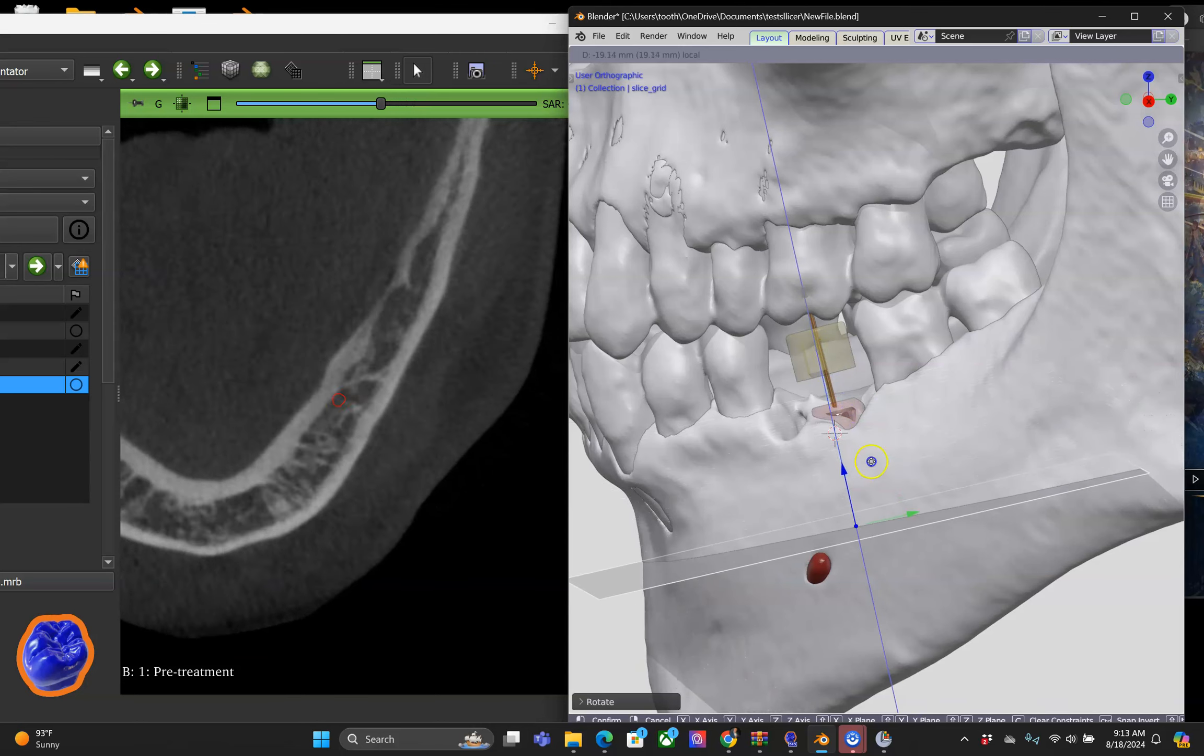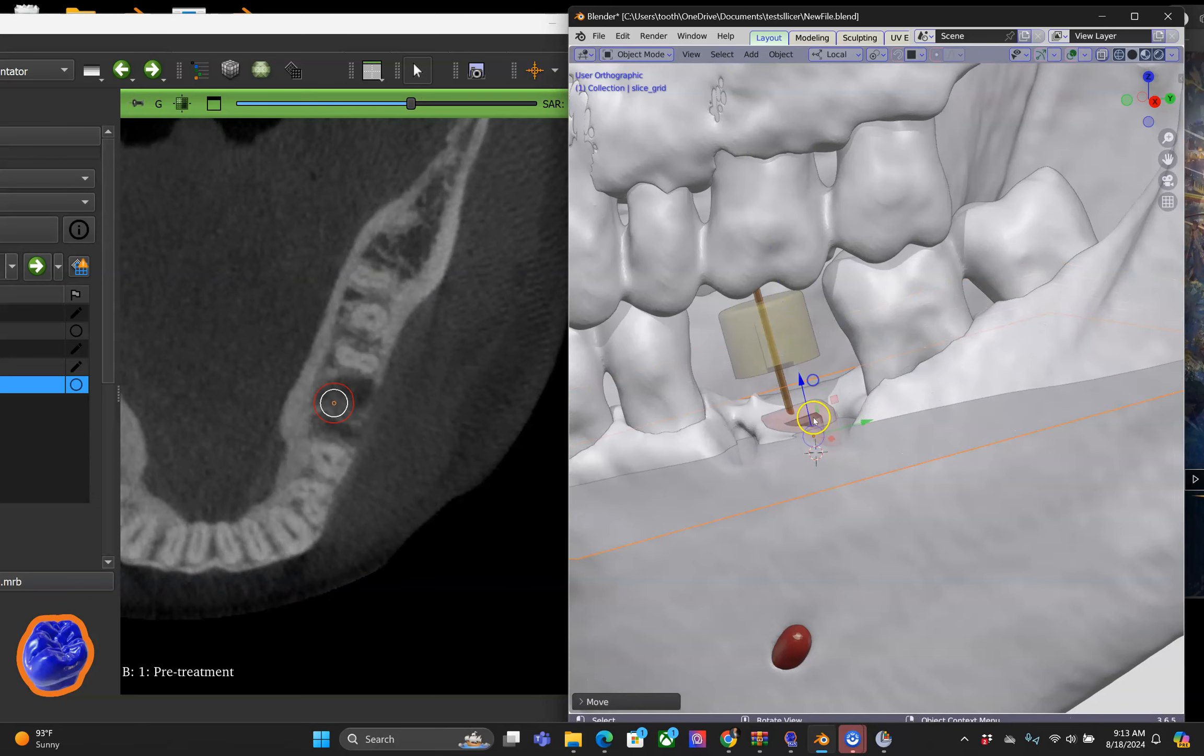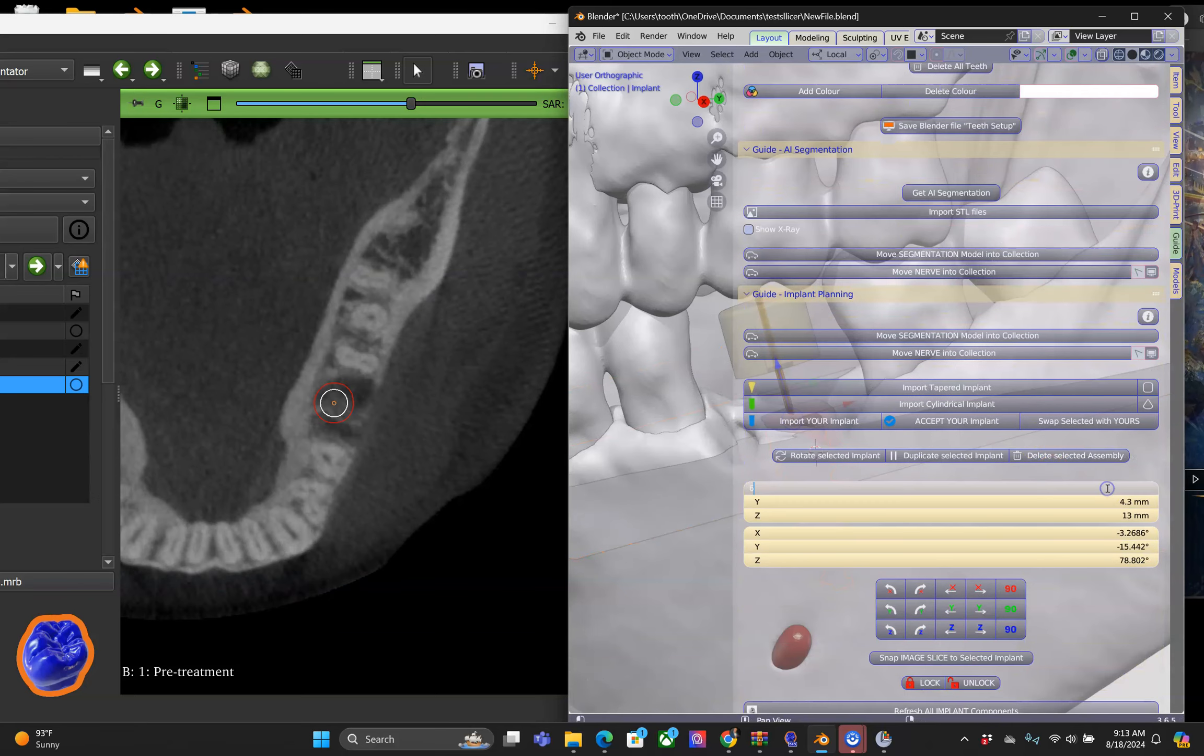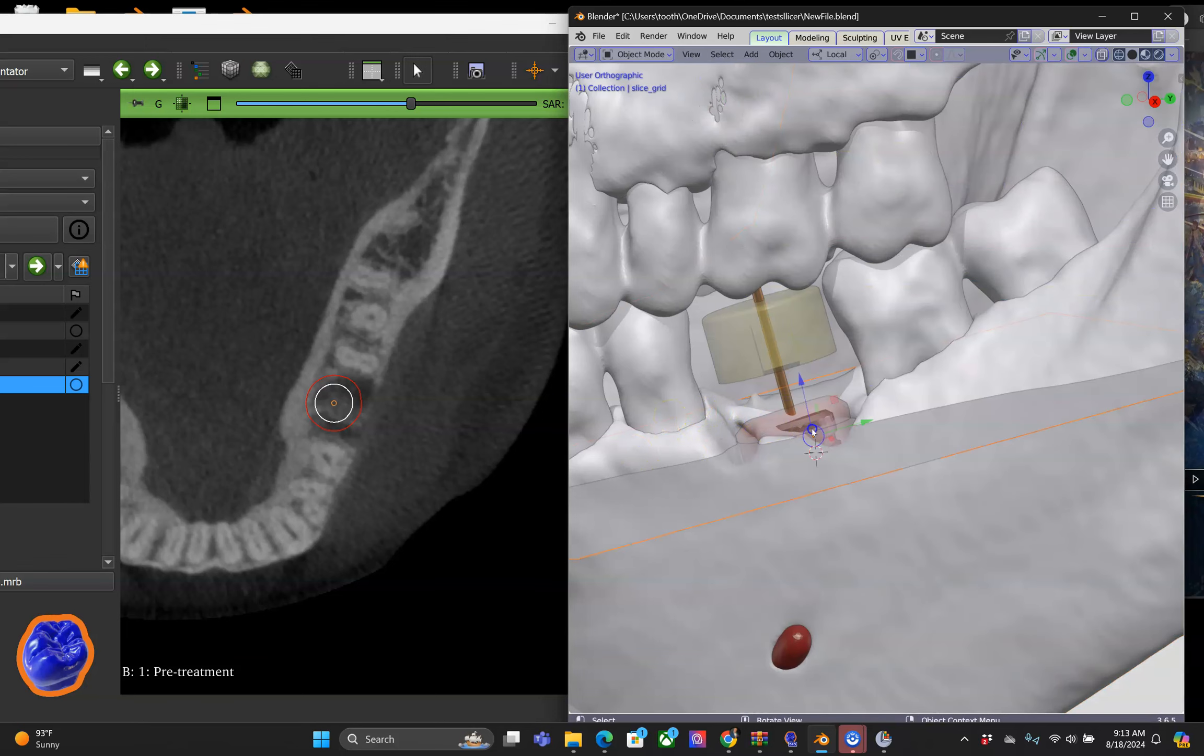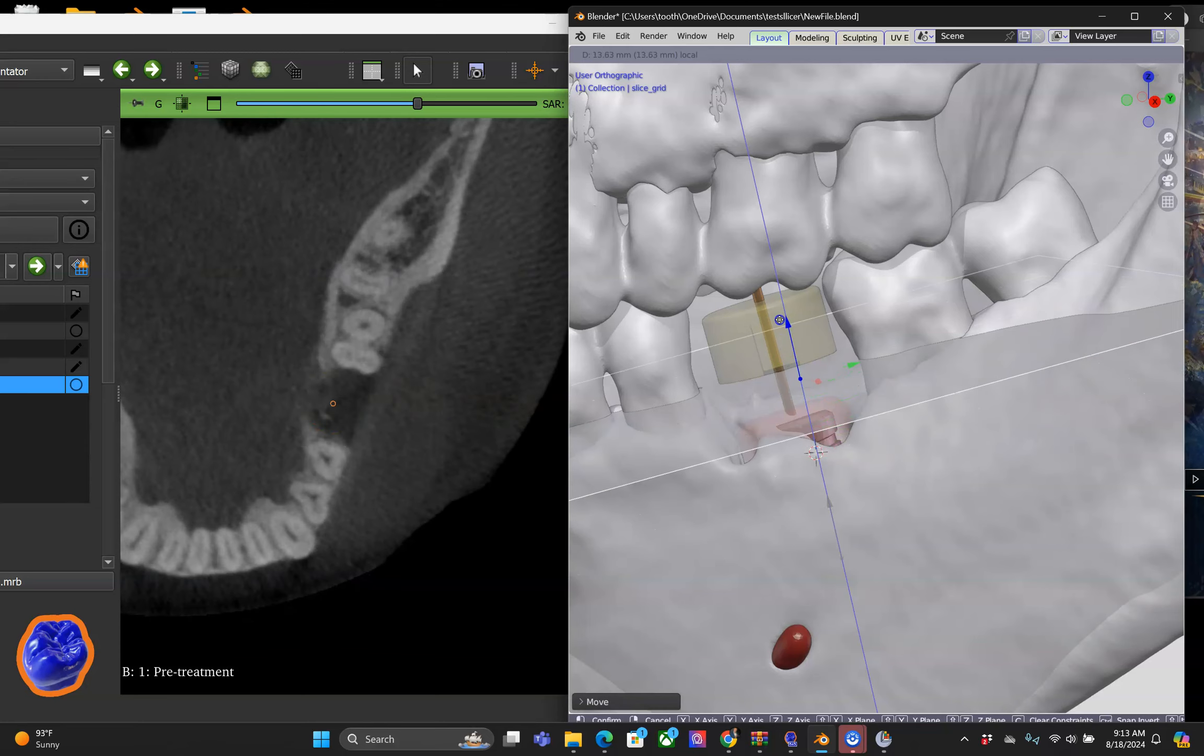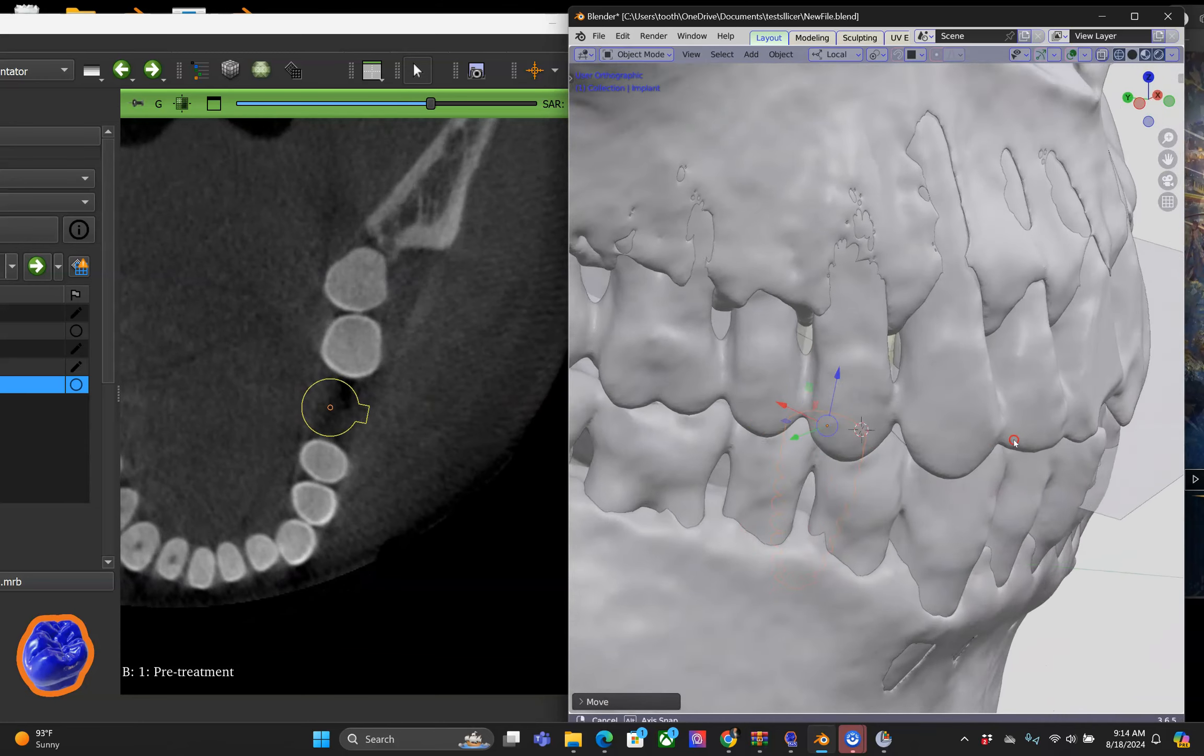Now you may ask how do we change the dimension of this generic implant, and this is very easily done. We just key in different figures for the dimension and the length and make sure that there is one that you can use within your product list.